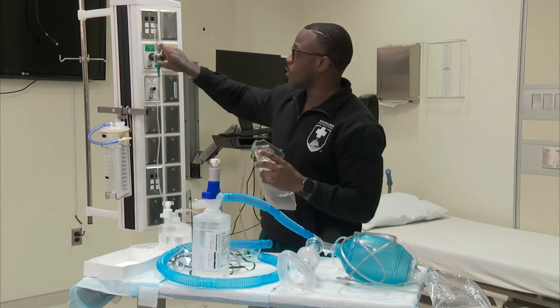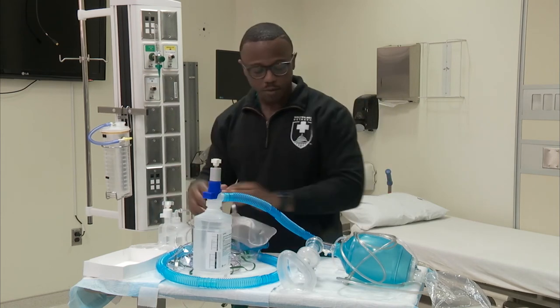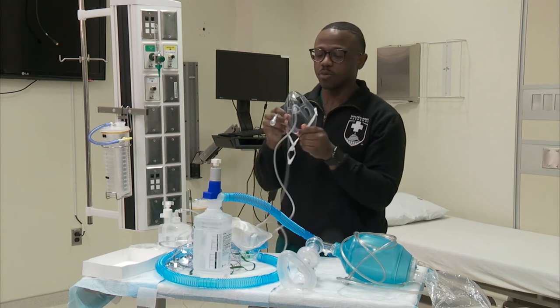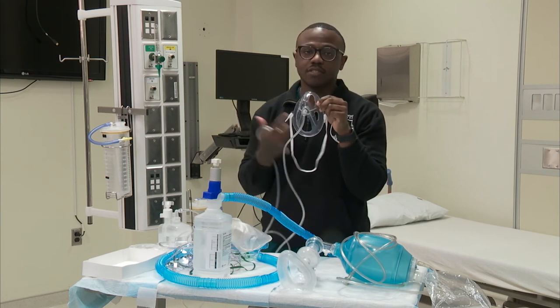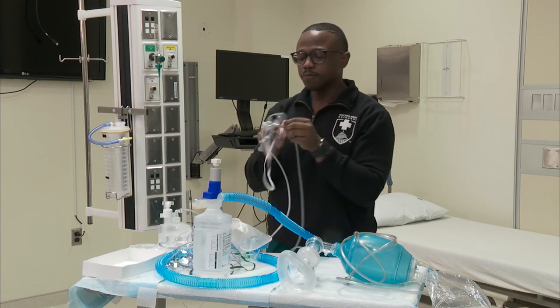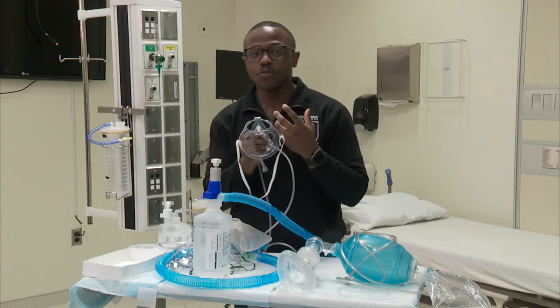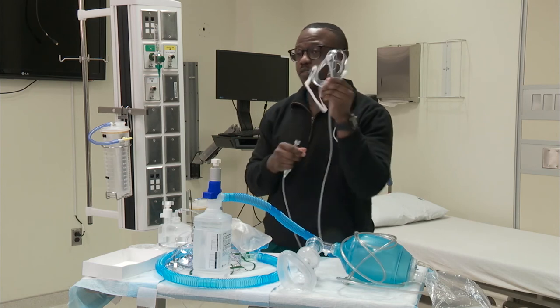Something that we in respiratory therapy love is the Oxymask. The beauty of the Oxymask is that it can safely deliver oxygen as low as one liter per minute all the way up to 15 liters per minute. It has large orifices or holes in the mask so the patient can drink, talk, and communicate better. In an emergency situation you have access for suctioning. Inside the mask, a pen with a bevel-shaped orifice directs oxygen directly to their nares and mouth, achieving the targeted amount of oxygen you want to deliver.